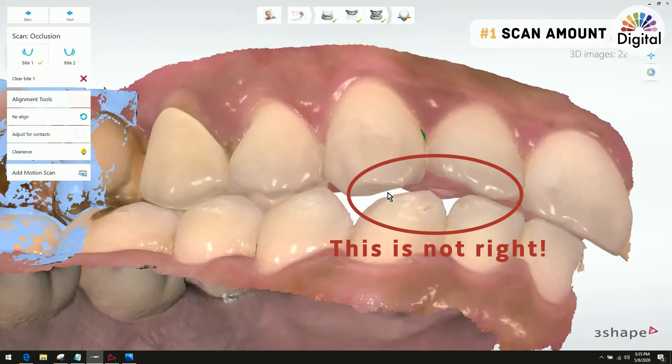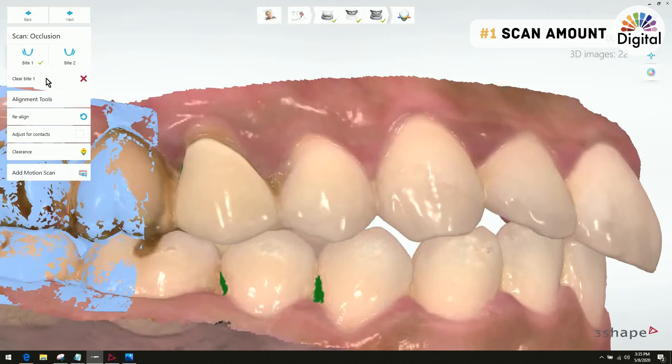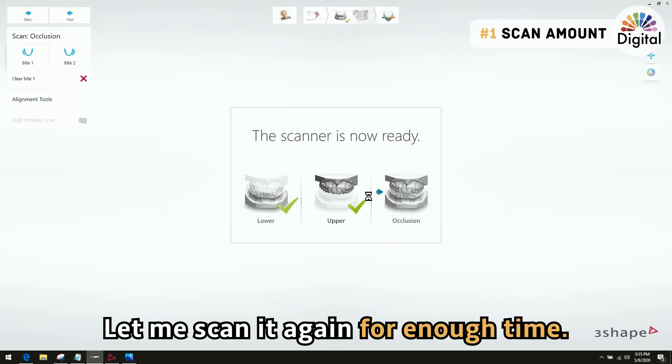There's a little over a millimeter gap there, but actually in my mouth I don't have that much gap. So what I suggest is: let me clear the bite scan out and scan the bite again.